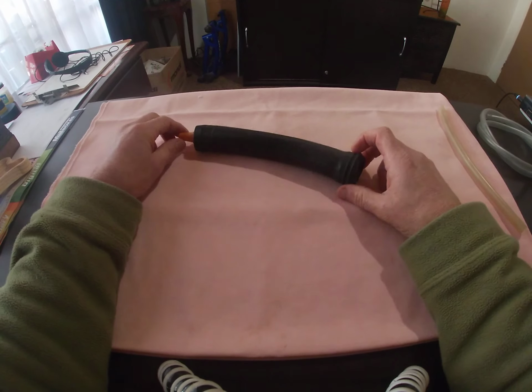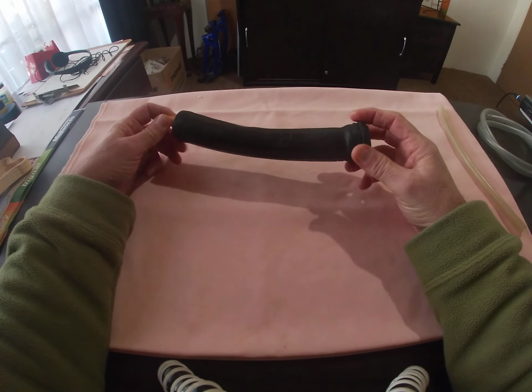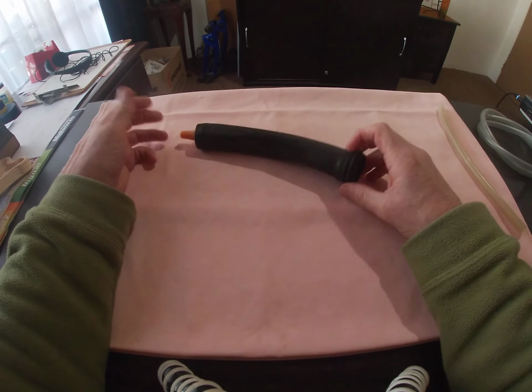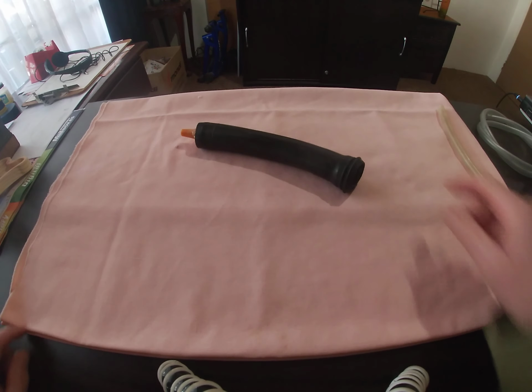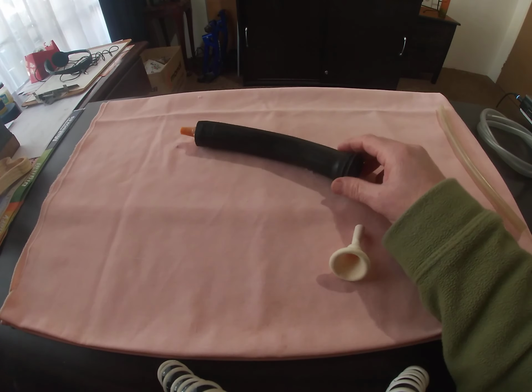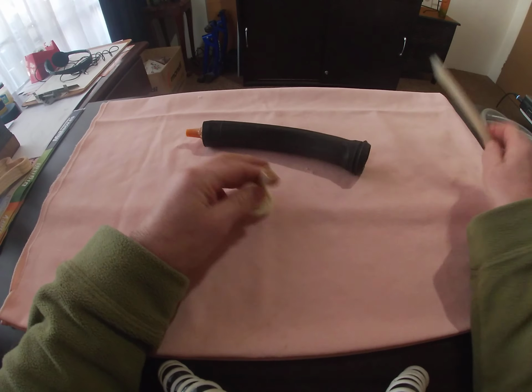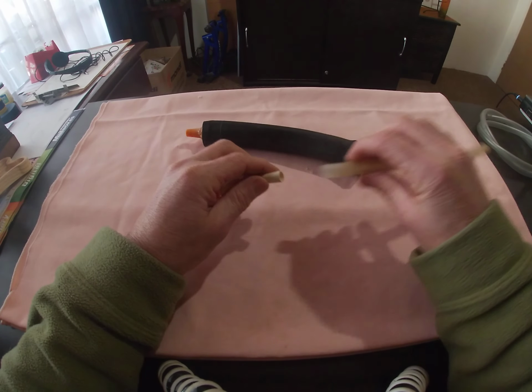So anybody out there that is going for a prostate operation and is looking for something that can help them, some information, this is my piece of information to you. Like I said, you can go out there, you can buy them, they're available, they look like this. And the only thing with this is it's soft, so you're going to have to make another adapter regarding these two parts, but I'm sure it can be done.